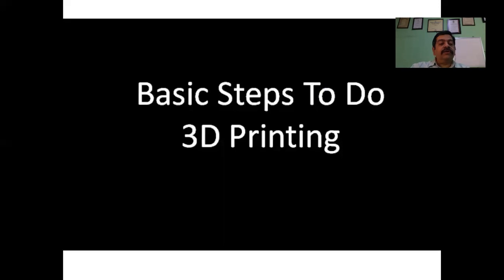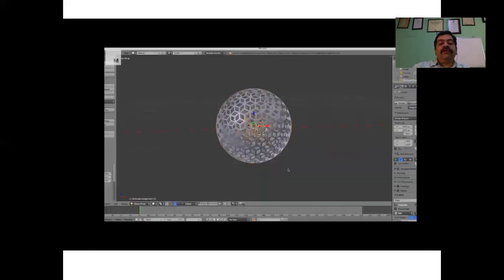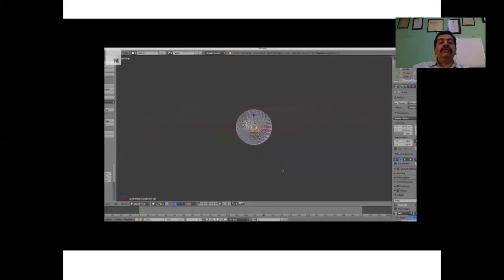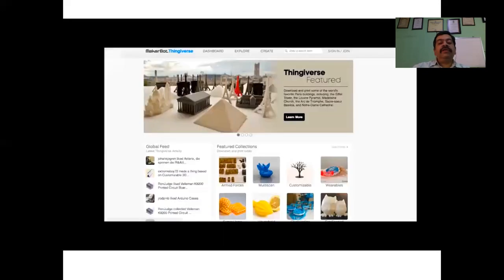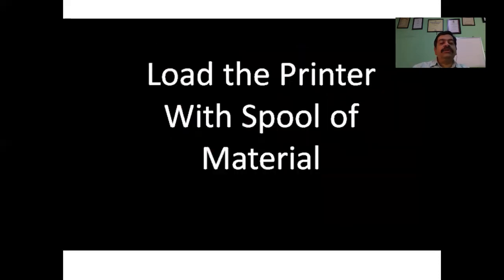If you have to start it as a hobby or start applying it into your practice, you need to choose a software. You need to do some virtual planning and make an STL file, or if you can't, you can download certain free STL files, which I'm showing you here from the internet, and practice your hobby or get to understand it. So you need to load the printer with the spool of material. There could be various materials which could be used.